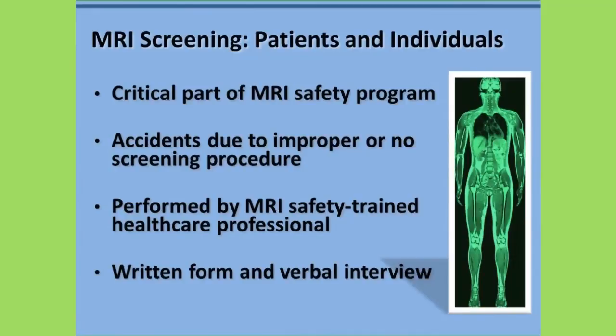The establishment of thorough and effective screening procedures for patients and other individuals is one of the most critical components of a program that guards the safety of those preparing to undergo MRI exams and protects the individuals entering the MRI area. Because many MRI accidents have been due to deficiencies in screening methods, especially with regard to preventing potentially problematic objects from entering the scanner room, it is crucial for MRI facilities to have appropriate procedures in place for screening.